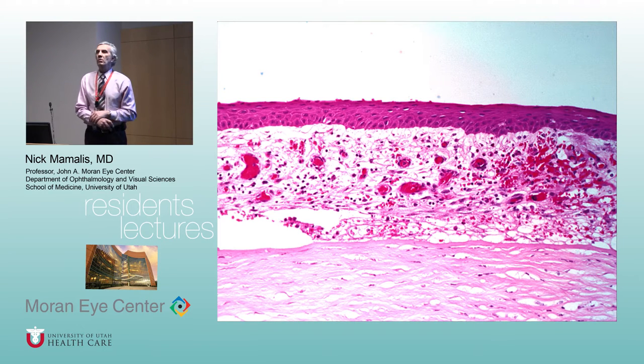Now, Nico, what's going on right here? So this is the cornea. The epithelium looks the right thickness. Bowman's layer, it's hard to say. I'm not sure if it's intact, especially to the right of the picture. You know what? No, Bowman's is intact. It's still there. There's a lot of proliferation and maybe vascularization and calcium above Bowman's layer. So what do we call that if it's growing from the limbus between Bowman's and epithelium? That's called a pannus.